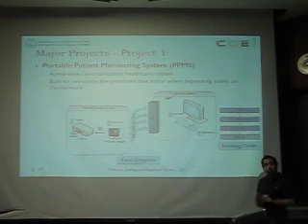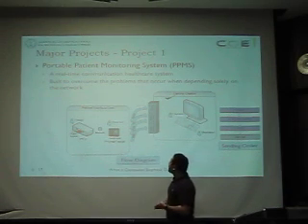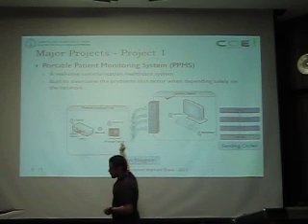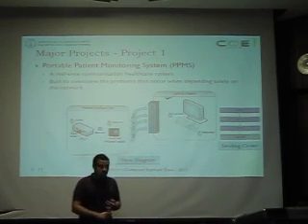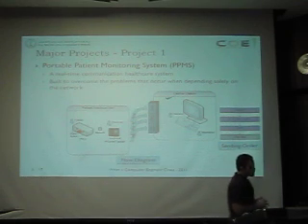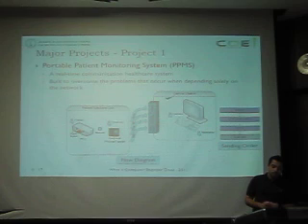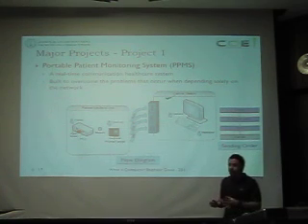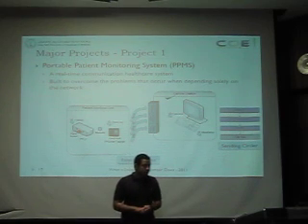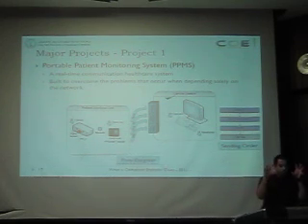As I said, we have 4 communication standards we are depending on. We have the radio, we have the 3G and GPRS, and we have finally the SMS. SMS only sends text data, so in that case, we cannot rely on the webcam, which is a part of the patient interface unit, to start a webcam stream on the patient.